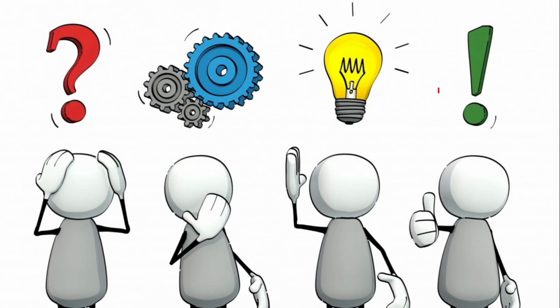So the scientists or the doctors, over a period of years, came up with multiple options, like breaking the artery and connecting it to a tube and returning the blood to the vessel, that is the vein. That was one option. But the problem was the tube used to get thrombosed. So then also there was a failure.